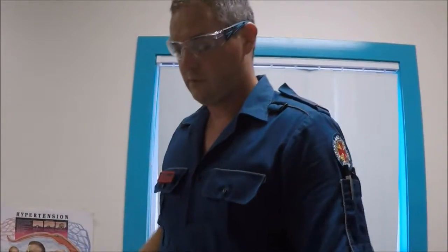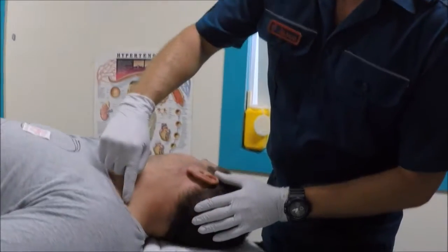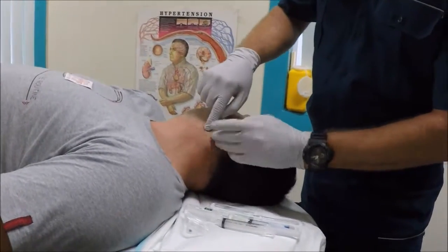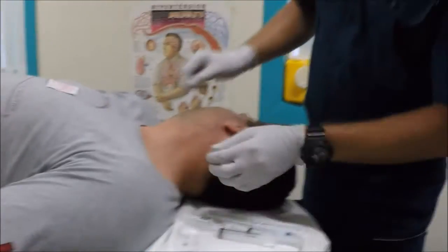Obviously with the availability of IO kits and how readily available and accessible they are, and how people are now trained in IO, someone who has a C-spine precaution would obviously be going for an IO if it was possible. So we can see that in this case Brian's EJ vein runs basically from the angle of his mandible to the medial aspect of his clavicle.